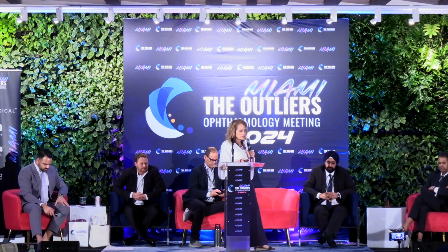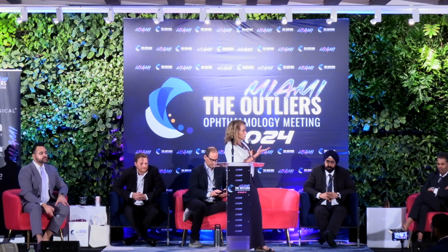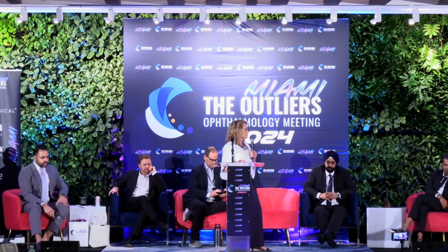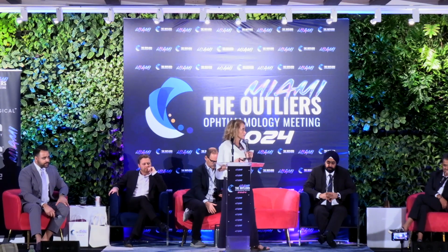So I really like the eye trace here too. It really is helpful because it shows this picture to a patient in a video. This is actually a video of what happens on the ocular surface as a patient is not blinking. In between blinks, you see that this is a patient with dry eye, and that inferior part of the staining, which you see in the picture as well, is just getting worse as they keep their eye open. So a picture with patients is worth 1,000 words. They may talk about other things that are bothering them, like blurry or fluctuating vision or irritation, but if you show them this, they'll say, oh, okay, I see that there's something wrong there. Red is bad, and they get that.